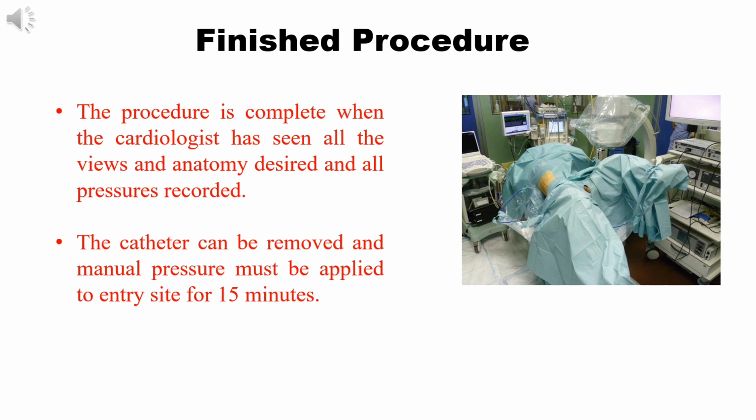Finishing the procedure. The procedure is completed when the cardiologist has seen all the views and anatomy and all pressures are recorded. After that, the catheter can be removed and manual pressure must be applied to the entry site for 15 minutes.